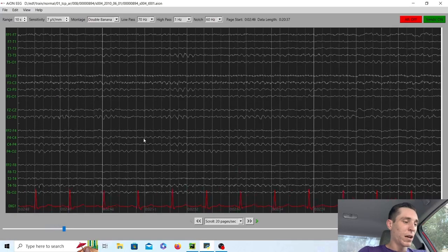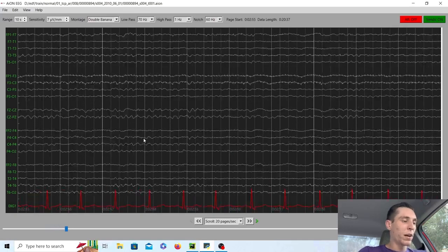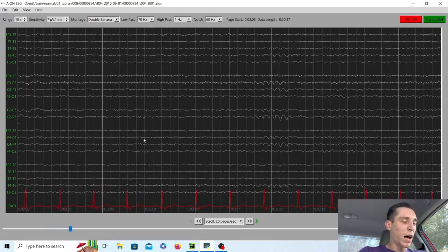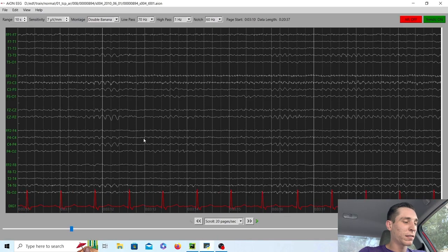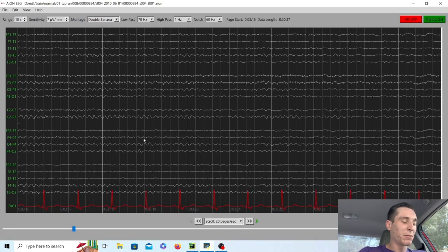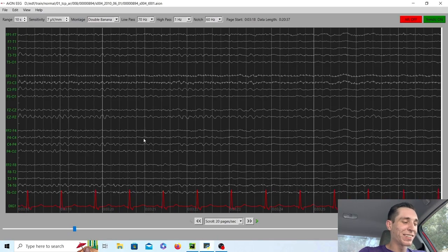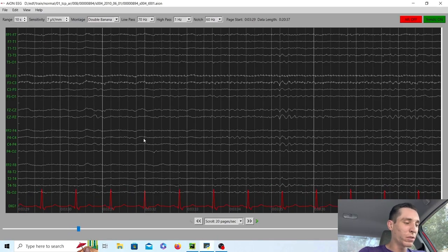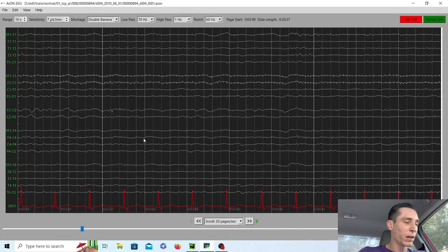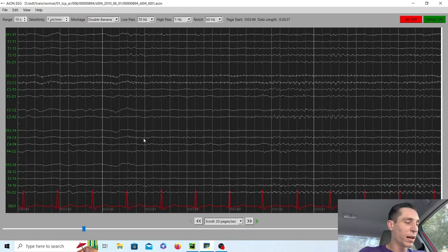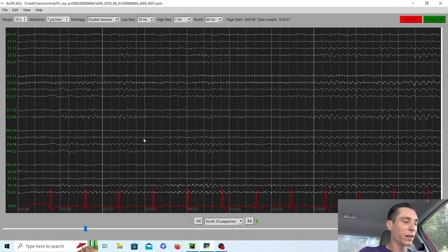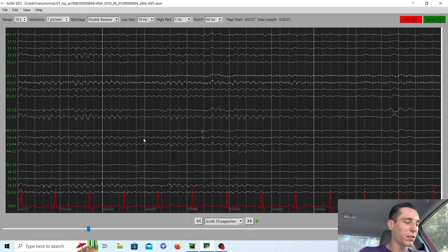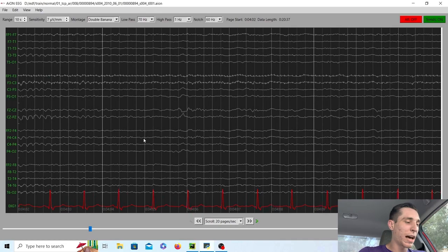And so the patient right now, they're laying down, eyes closed, relaxed. I can only imagine since I don't have the video, but we don't see very much muscle artifact. It's essentially a very clean record. You can tell the patient is pretty relaxed.